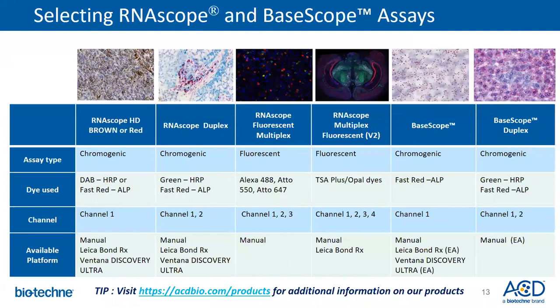So that's a good point. There are some applications we just don't have good antibodies for at all. GPCRs is a big one, for instance, and long non-coding RNAs. This would be a really great way of looking at that. Secreted proteins is another one. You can stain for secreted proteins, but you're just going to get a wash of signal everywhere. Versus if you have an RNAscope probe against that transcript, you can see exactly what cells are producing that protein, even though it travels far away.